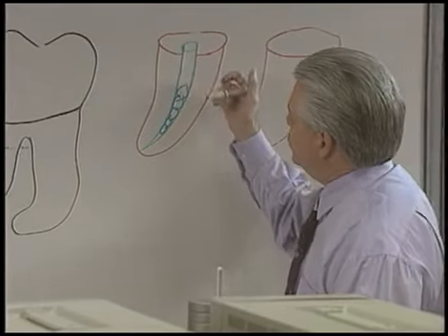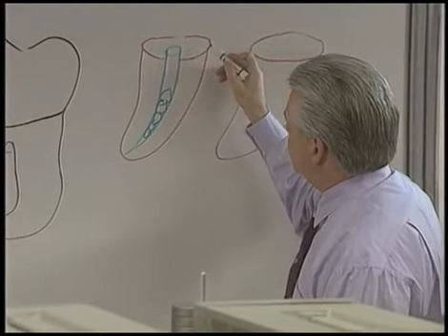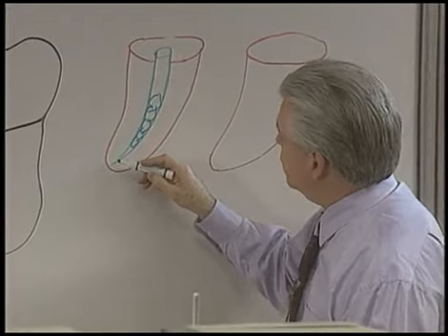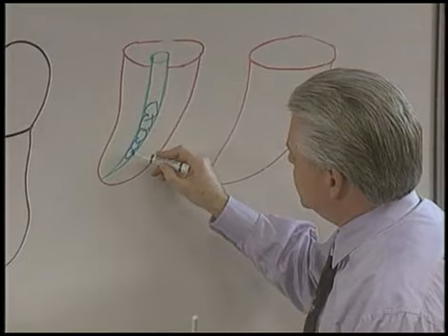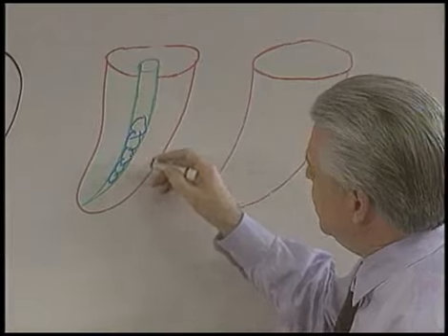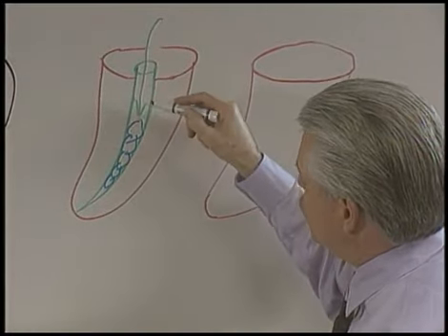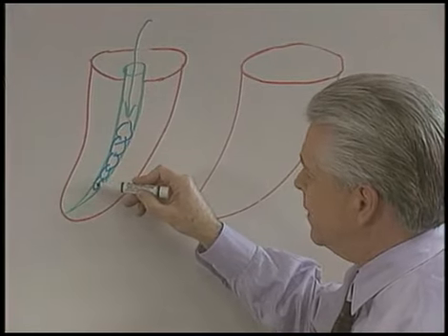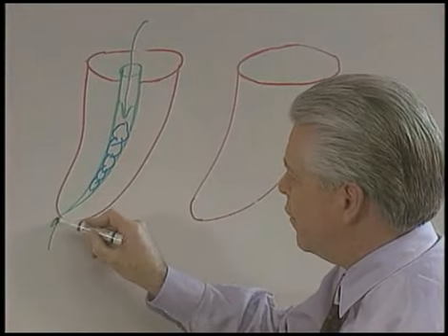This particular root is frequently quite round, and the canals that are harbored inside the roots are relatively round. So when an instrument gets broken in this canal, the root's relatively round, the instrument is theoretically round, and it makes it difficult to negotiate and try to bypass the fragment, even though with effort and chelators sometimes we can reach the terminus.